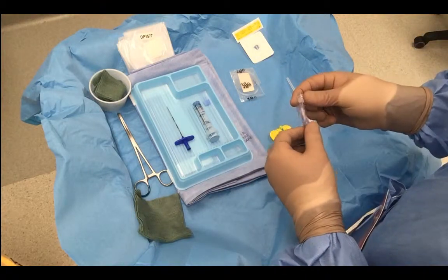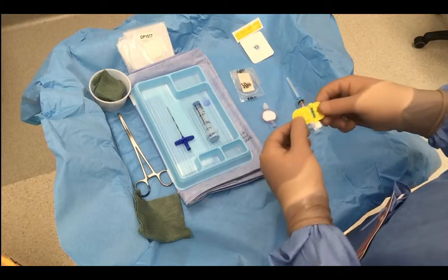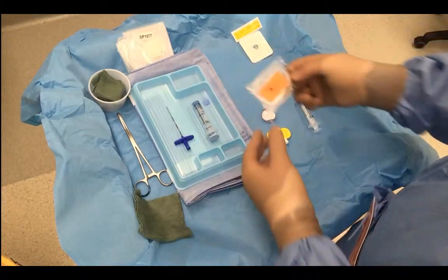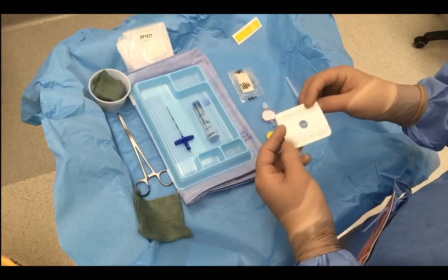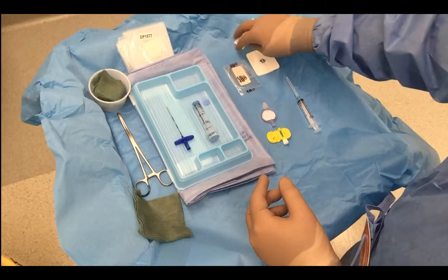We've got a catheter filter, a microbial and bubble filter. We've got a catheter attachment hub, our epidural catheter. This is an 18 gauge. We've got an epidural catheter lock, and we've checked that that's the same gauge appropriate for the catheter.